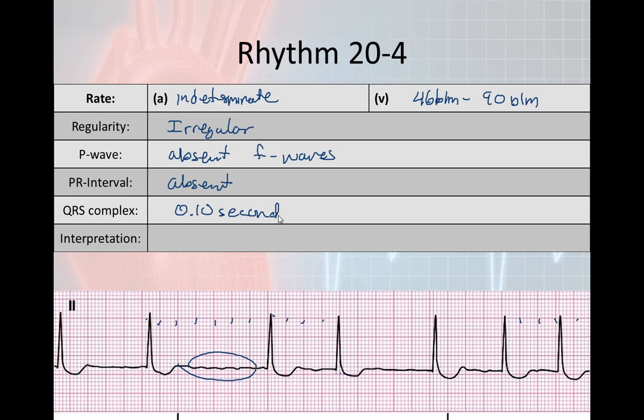The nice thing about doing a 12 lead is that it would measure the QRS for you to really give you an accurate one, because the circuitry has a better way of determining the beginning and the ending of ventricular depolarization. So because we have our F waves here, we have a controlled AFib. Almost too controlled. I mean, look at that slow rate right there.